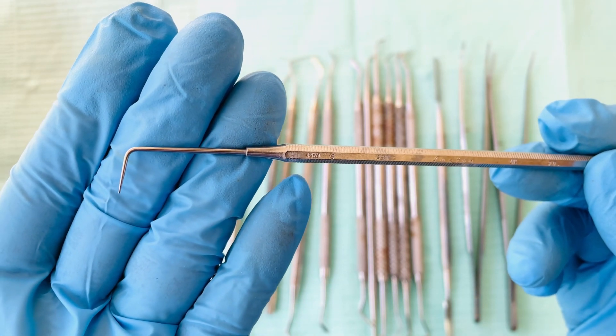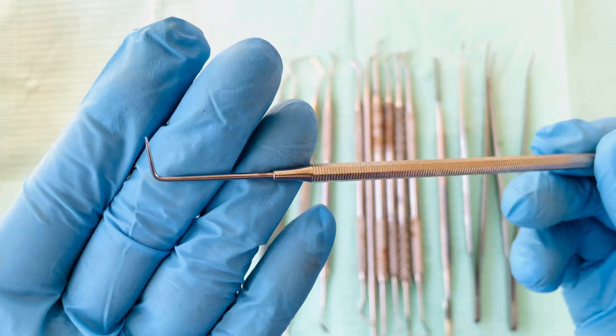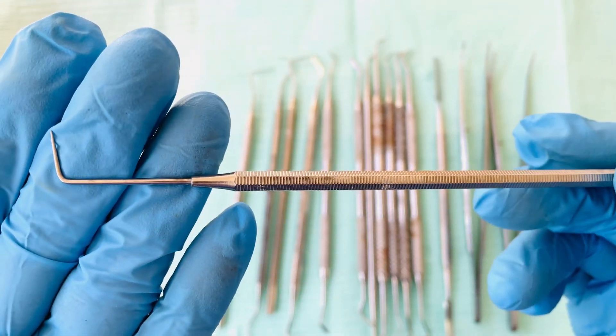In other countries they use an explorer, which I'm going to be showing you next. So this is the straight probe.